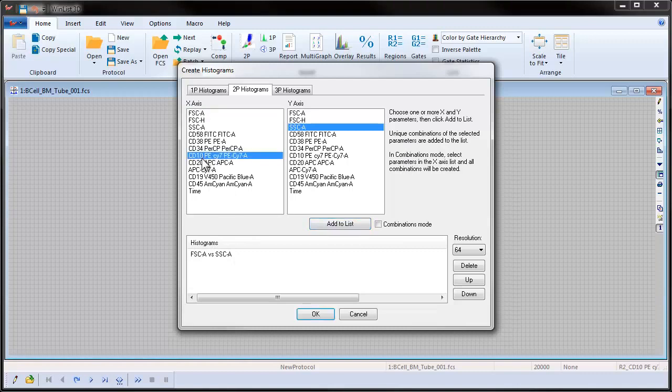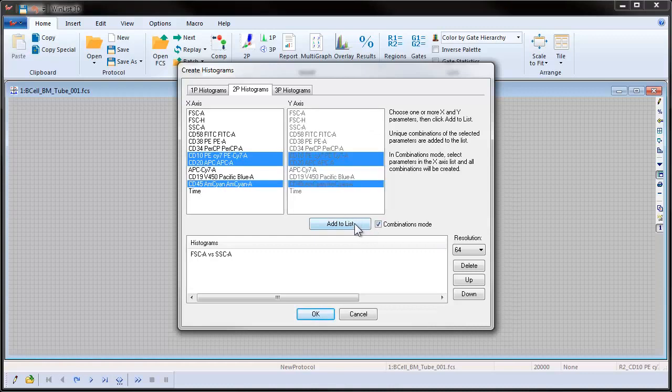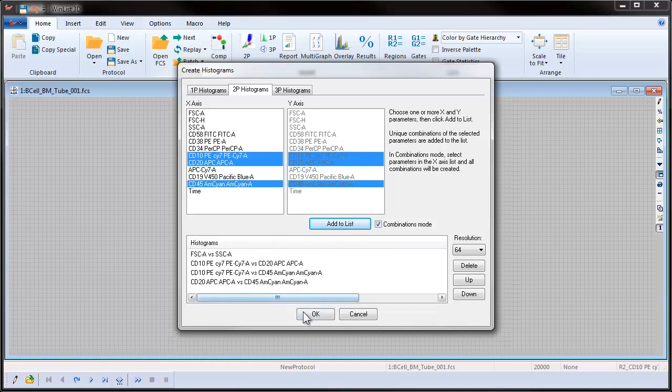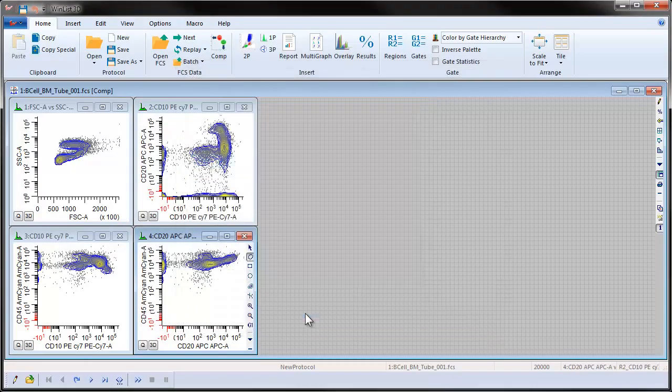Then we'll select CD10, CD20, and CD45. Click Combinations mode and then click Add to List. Click OK and WinList will create the chosen histograms.